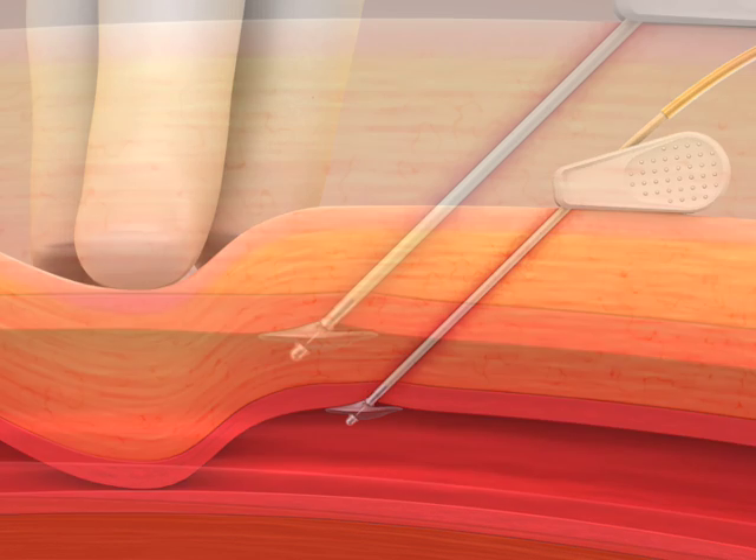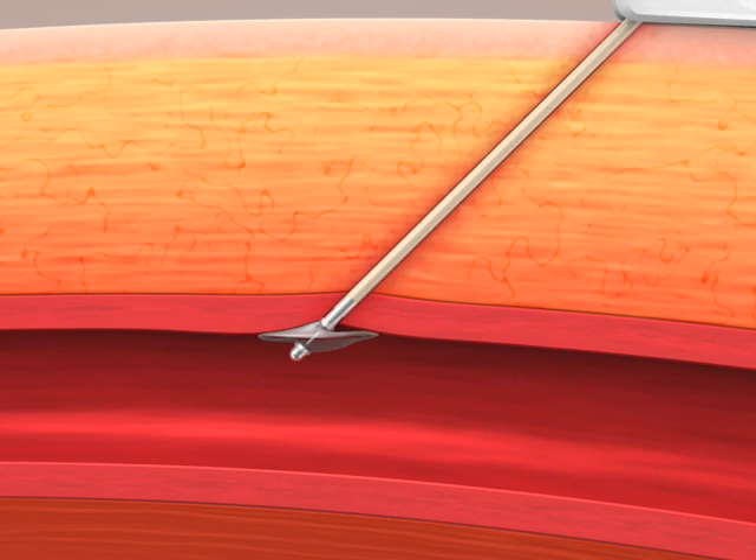To remove the device, the disc is collapsed and the device removed by gently depressing the black end segment.